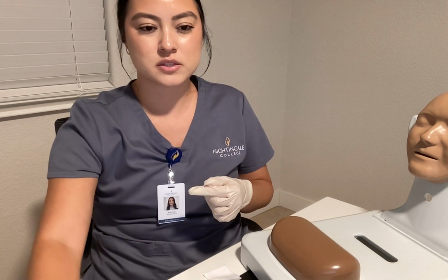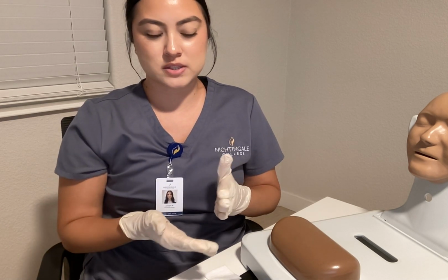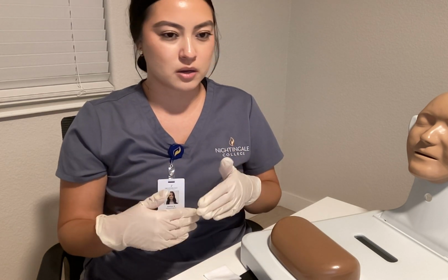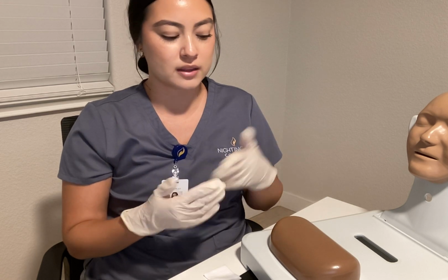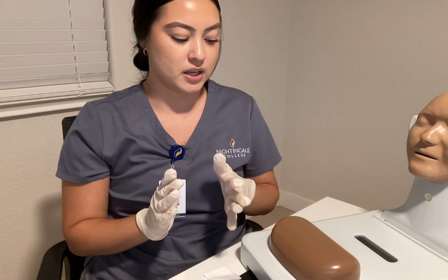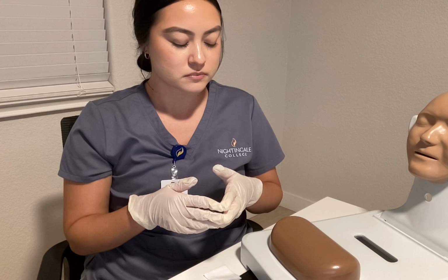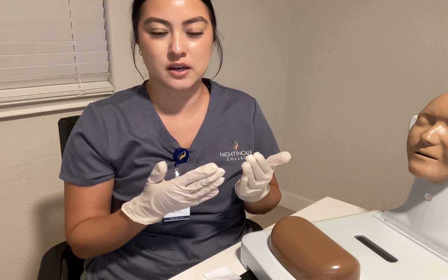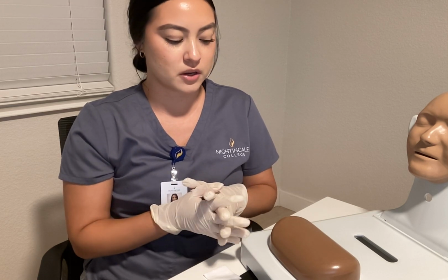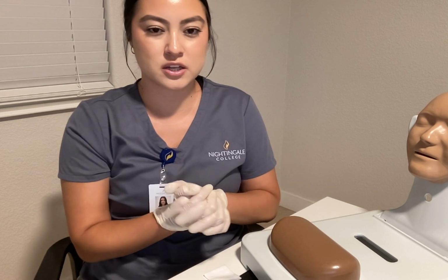So once we have this drawn up, we are going to go ahead and choose the appropriate site for injection. Again, this is typically injected in the abdominal area, so we want to go ahead and look at the patient's abdominal area for any bruising, inflammation, any edema, anything that would prevent us from injecting in this area. If there is any of these noted once we examine the patient, we can go ahead and choose a different area for injection. Again, this is a subcutaneous injection.